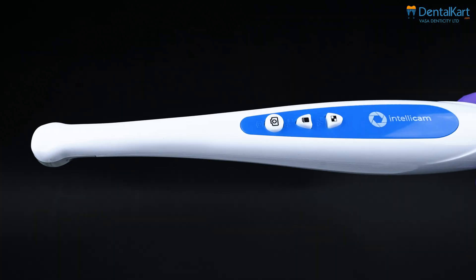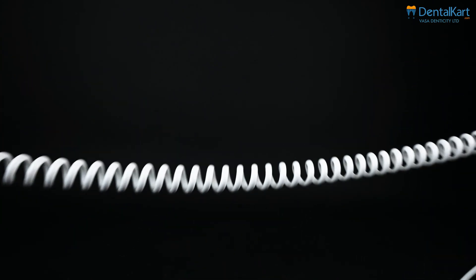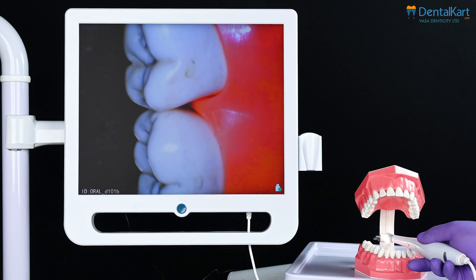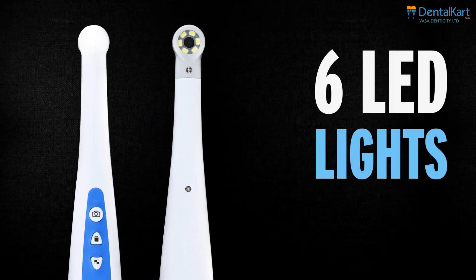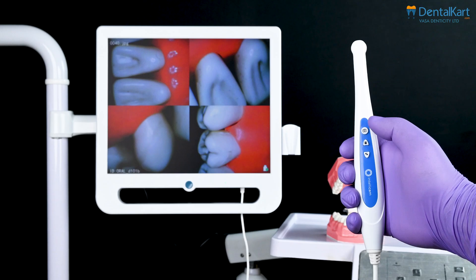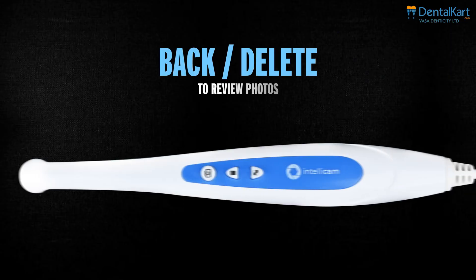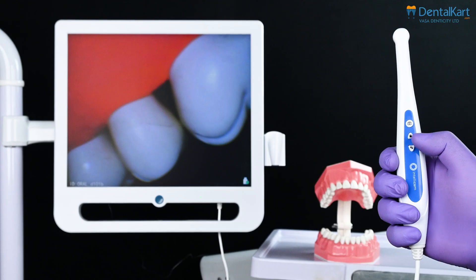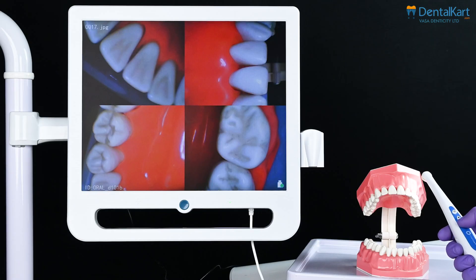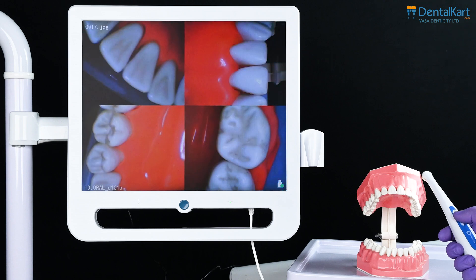Coming on to the camera handpiece. The camera handpiece includes a handle with a cable for flexible maneuverability during dental examinations. The intraoral camera features six LED lights for clear illumination. The capture button: press it to take a photo and enter photo mode in view mode. Back/delete: to review photos, press the button, select an image to delete, hold the button until the delete option appears, then press again to confirm deletion.